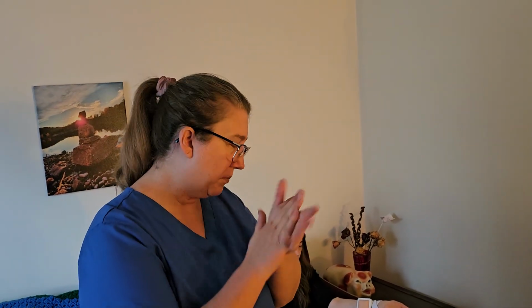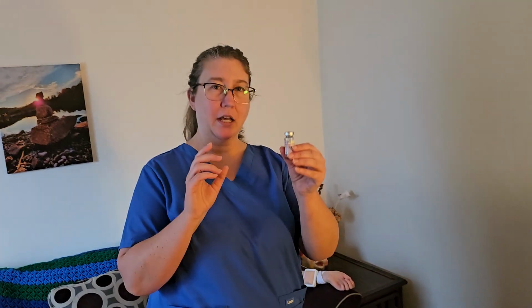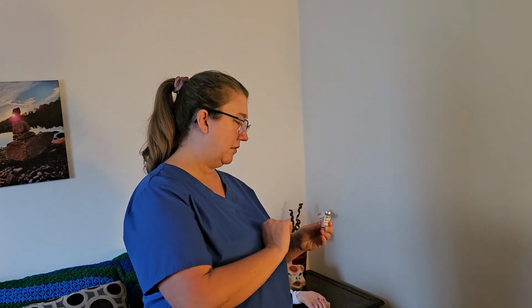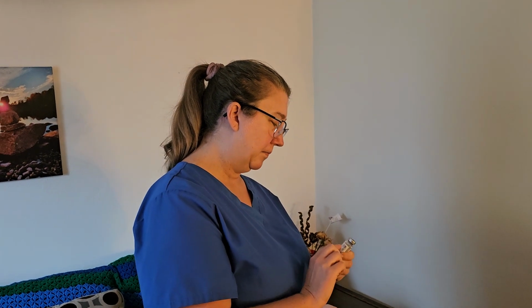After performing hand hygiene, I'm going to grab the vial that has her medication in it for the TB test. I'm going to check it against the MAR, and it is the correct serum, and I'm going to see how many units I need. I'm going to take an antimicrobial wipe and clean the top of the vial. Now I'm going to let that air dry.